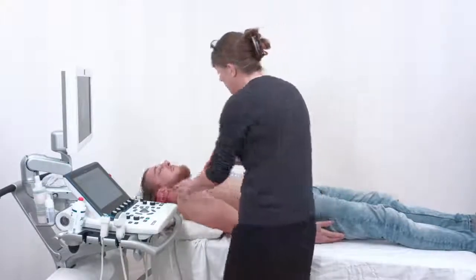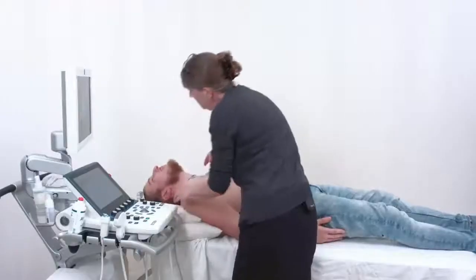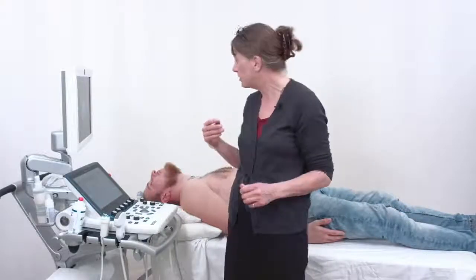So Kim, if you don't mind, I'm just going to put these pillows underneath your shoulders and then ask you to extend your neck down like that. We need to be quite careful with this view. It's not particularly comfortable, and it's certainly not for the elderly if they've got stiff necks. And having pressure there at the suprasternal notch is quite unpleasant, so it's always a good idea to keep checking that the patient's feeling all right.